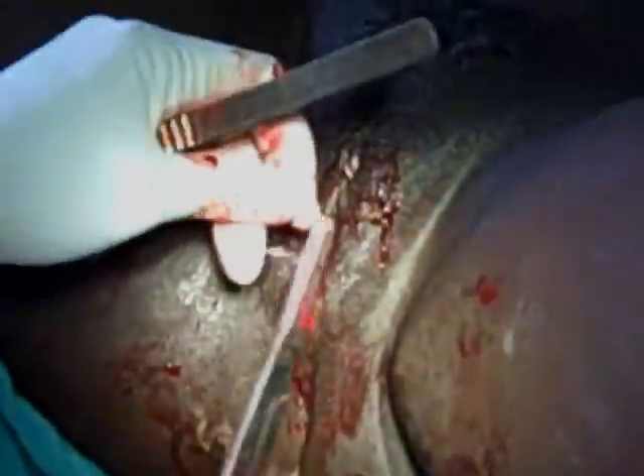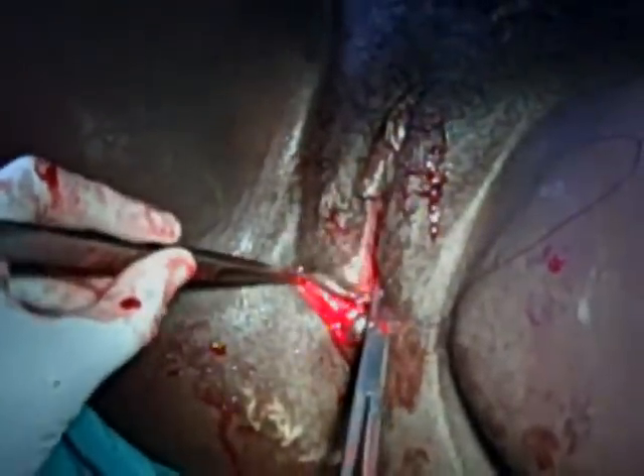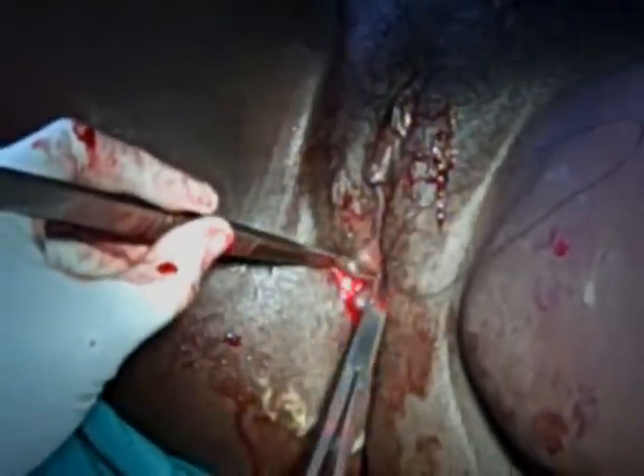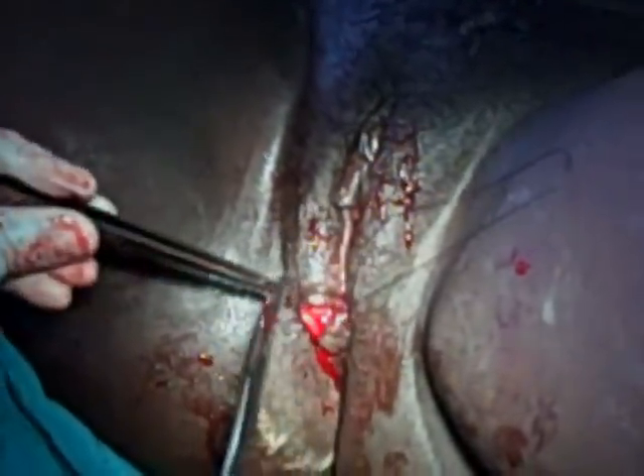The next stage of the repair is to now suture the perineal muscle. In the previous video, the surgeon brought the stitch out through the perineal muscle, and now using this same suture, the perineal muscle is sutured. The surgeon picks one side of the perineal muscle and then opposes it to the muscle on the other side.